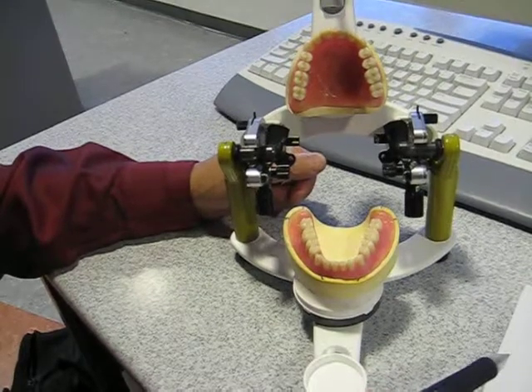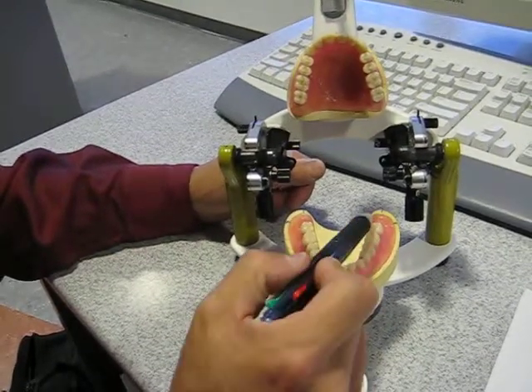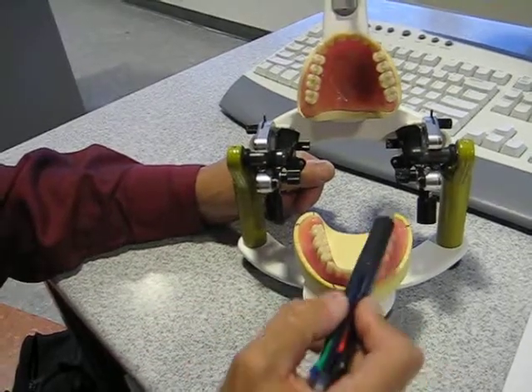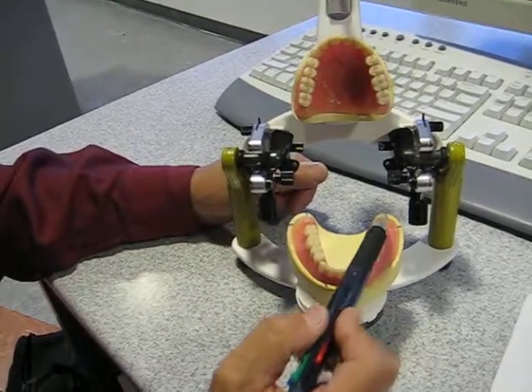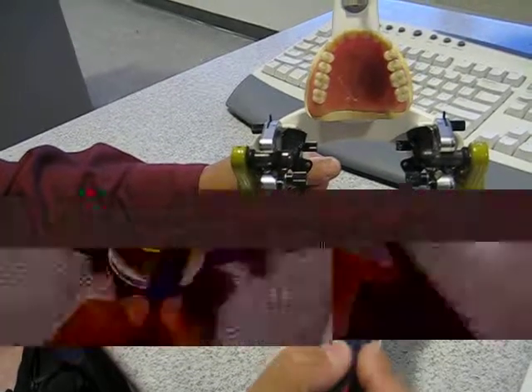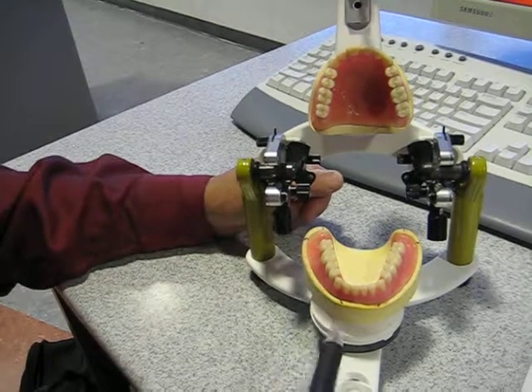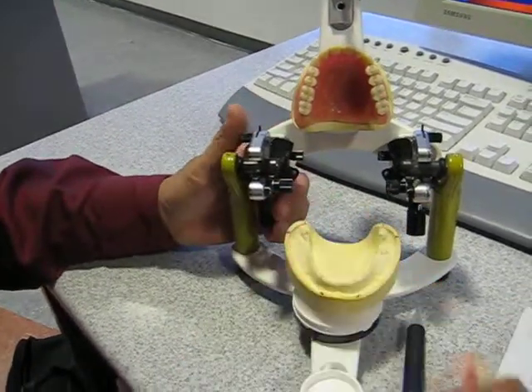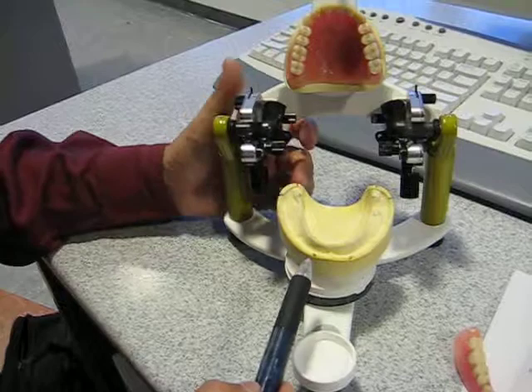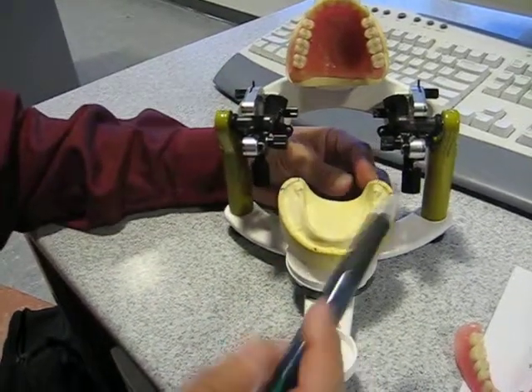Now, in terms of the relationship of the posterior teeth to the ridge, one of the first things that we're going to look at is the most critical arch in relation to this, and that refers to the tongue space as well as the position of the tooth within the arch form, which is the relationship between the mandibular posterior teeth and the residual ridge. Now, what we want to do is make sure that our reference marks are correct and they appear to be lined up nicely.